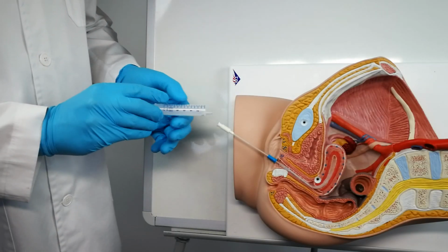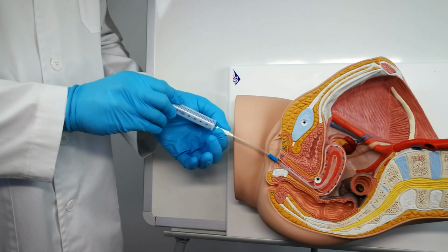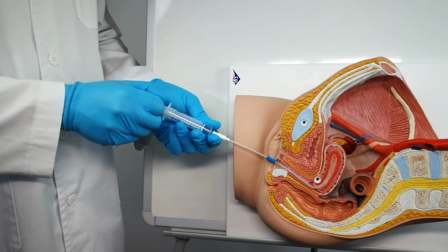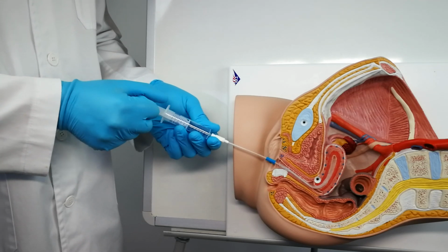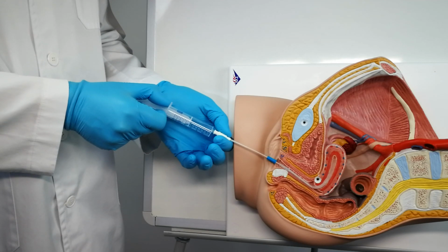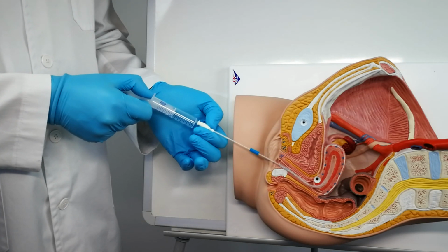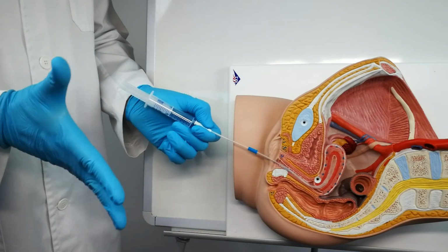Hold the catheter in a fixed position and connect a 10 ml syringe to start the aspiration by carefully actioning the plunger 3-4 times. It is normal to feel negative pressure when actioning the plunger, and also that the plunger comes forward when aspirating. Holding the aspiration, move the catheter outwards and stop suction at the entrance of the internal cervical os. At this moment, the plunger will come back to its original position.